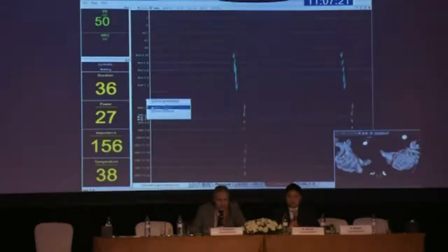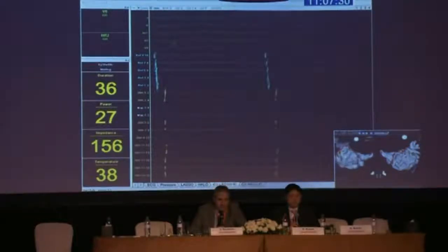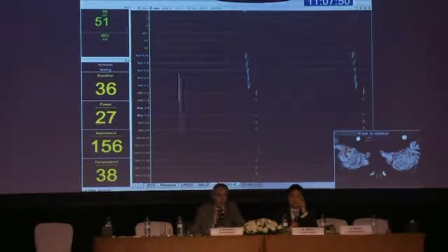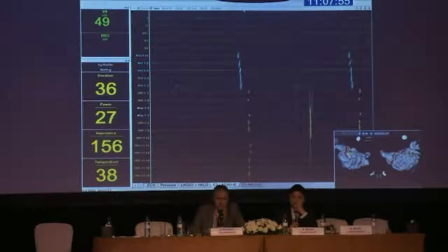Okay. Do you pace in CS to see better, or do you just rely on sinus rhythm? Well, I think now it's so late, isn't it, that there's quite a clear distinction between the far field and the local, that I don't think that's going to be necessary. So I'm just going to explore around the vein. I've put the mapping signal right next to 5/6 to allow me to time it without having to ask Neil, our gorgeous technician, to continually update the timings for me.